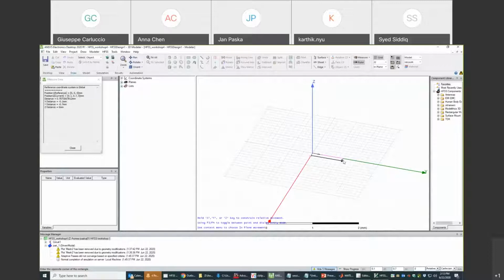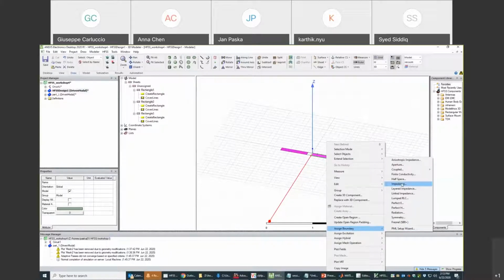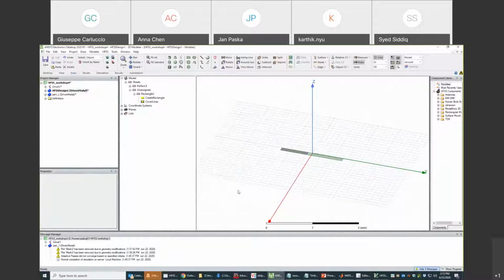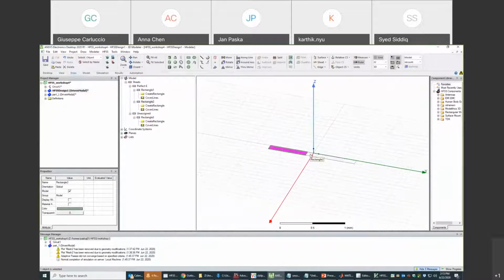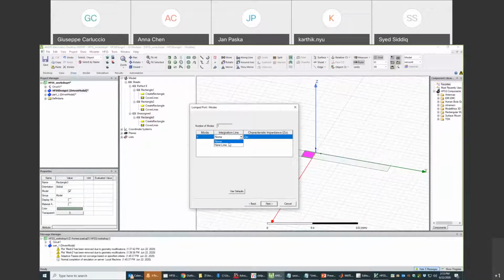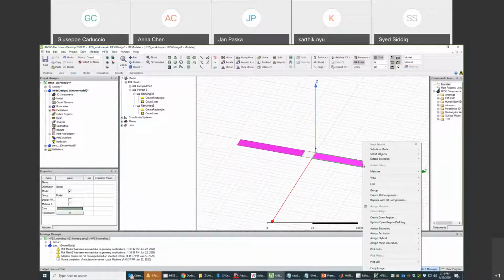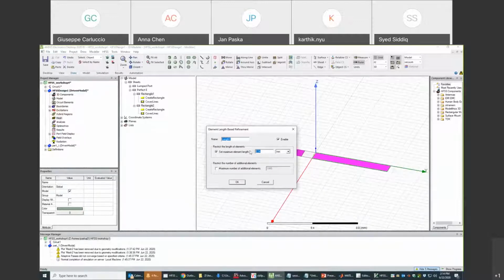Let's say we want to build a dipole array. So I will make like a dipole. Assign these perfect electric conductivity. And here a port, for example. And then we set up the boundaries, we set up the excitation, we can give a local mesh: assign mesh operation on selection, length based. So let's just say 0.2 millimeter.